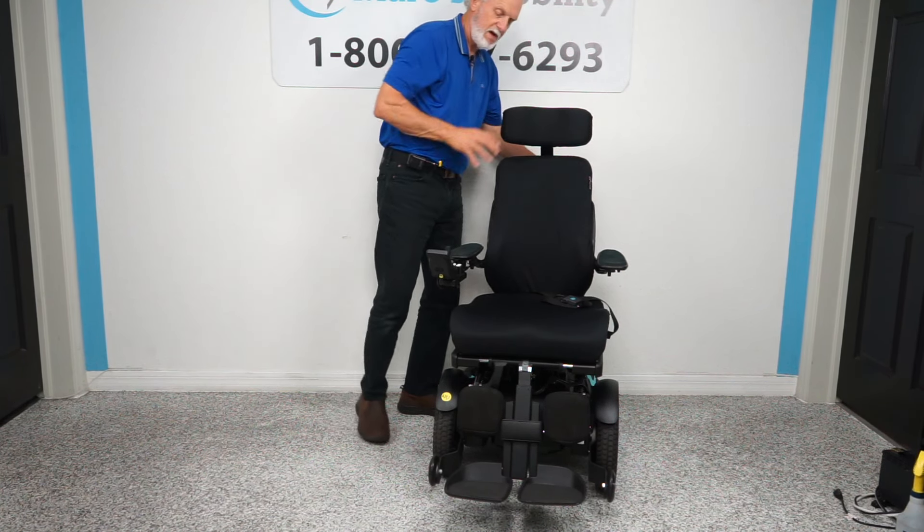Let's recap: this is a Permobil F3 with 15 miles on it. It has five functions — 12-inch seat lift, electric tilt, electric recline, electric feet, and interior tilt. It has the swing-away joystick, flip-up arms, 20 by 20 seat, safety belt, contoured back, extra-large headrest, bag hooks, solid tires which won't mark your floor, and suspension.